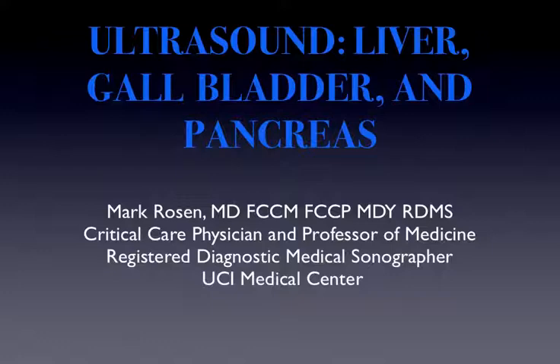And this, as you know, is ultrasound for the liver, gallbladder, and pancreas. Now, for those of you who are relatively new to ultrasound, I'll just give you my personal bias. I think clinically the ultrasound exam for the liver and gallbladder are quite important in the emergency department and in the intensive care unit as well as general medicine. The examination of the pancreas is somewhat more difficult, and we'll get into that in the lecture.